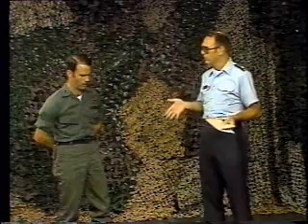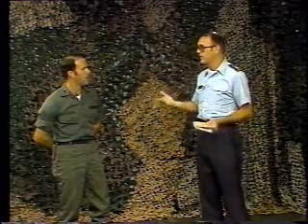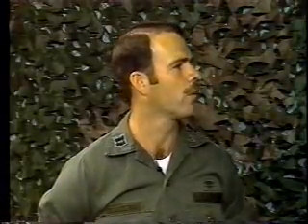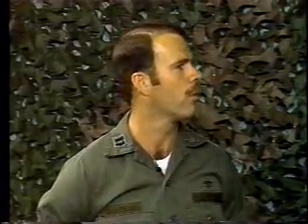What's the importance of litter carries? I mean, anybody can do it, right? Well, you might think you could just pick up a litter and move out, but there's lots of times you're going to be going over all sorts of terrain, different types of obstacles, in and out of vehicles, buildings, and things. And there are certain ways that we can do things with the litter that make it a lot easier and safer for the patient. And that is our primary concern, right? Absolutely. Safety of the patient.